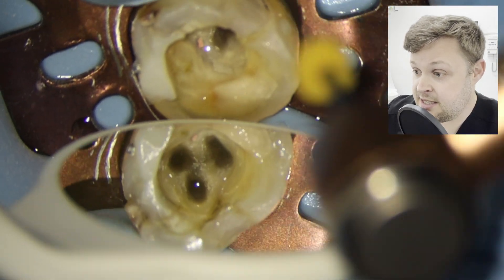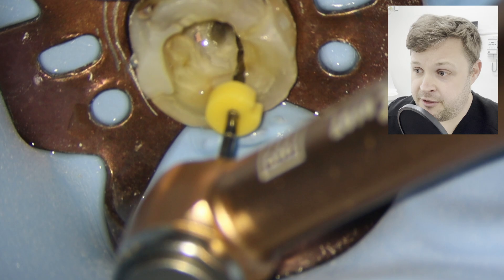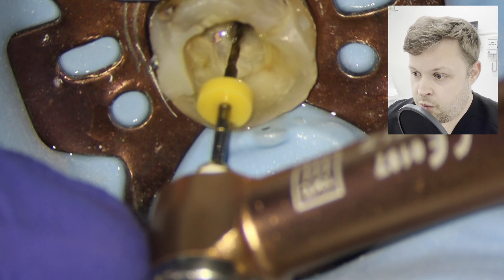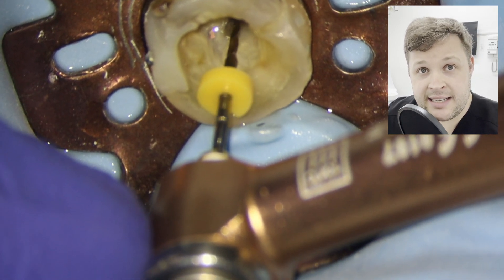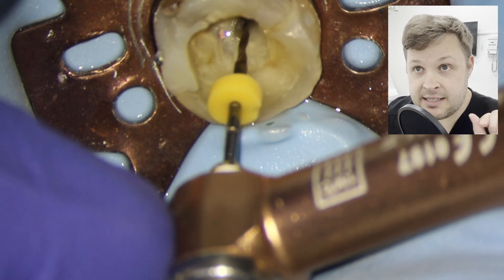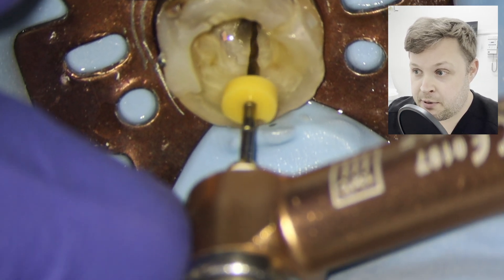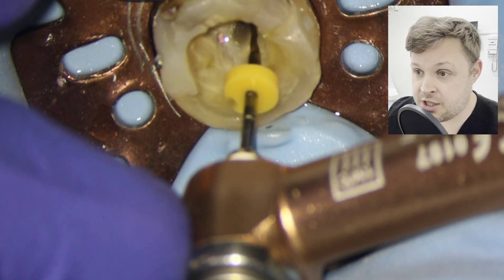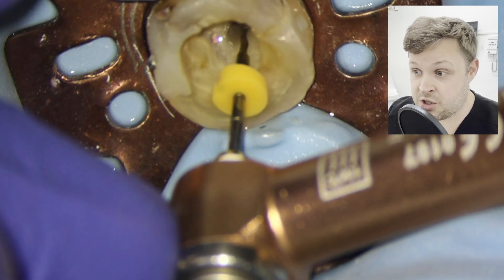So let's have a look at the case. I'm using a Hyflex 1503 rotary file here, and I'm actually using it in T mode. With T mode, basically it reciprocates 90 degrees first. Then when you feel the file is moving past the ledge — because T mode is for ledge management — you press a button and it rotates and tries to bring out the ledge. In this case it was a retreatment and I felt a ledge, which is why I was using T mode.